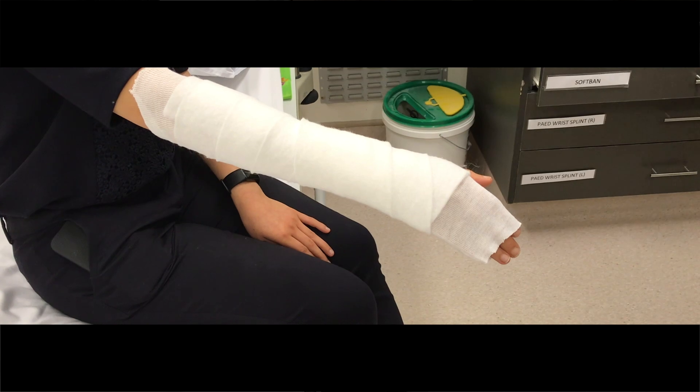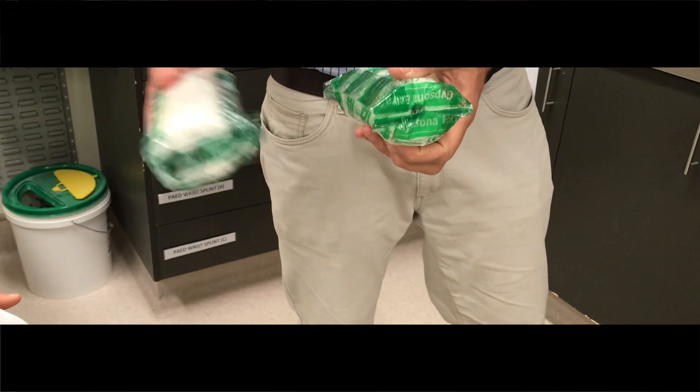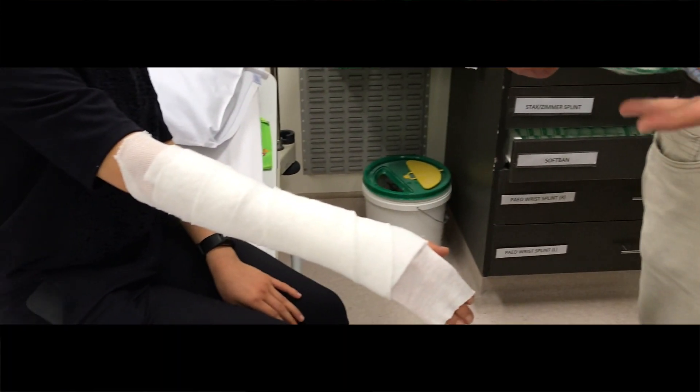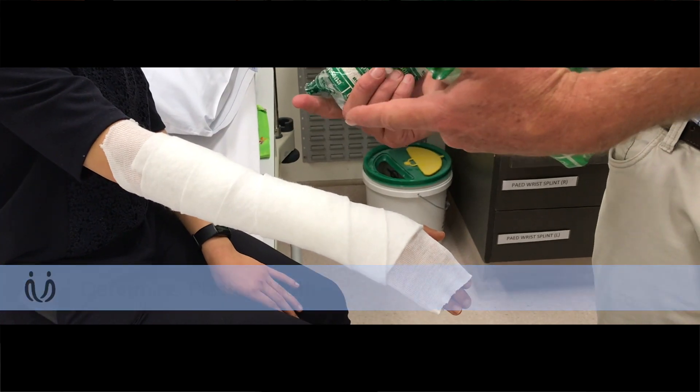So this is the plaster — it's pre-impregnated plaster in there. It depends on the patient's size. If you've got a huge forearm and a big build labourer, then you probably need something that wide. If we put that on you, it would probably go all the way around your arm and effectively do a full plaster, so we don't want that.